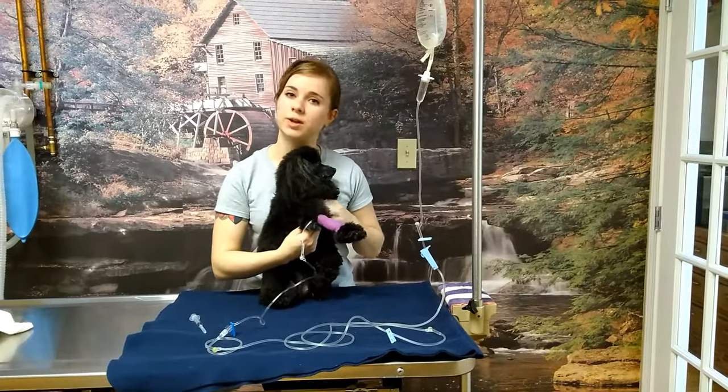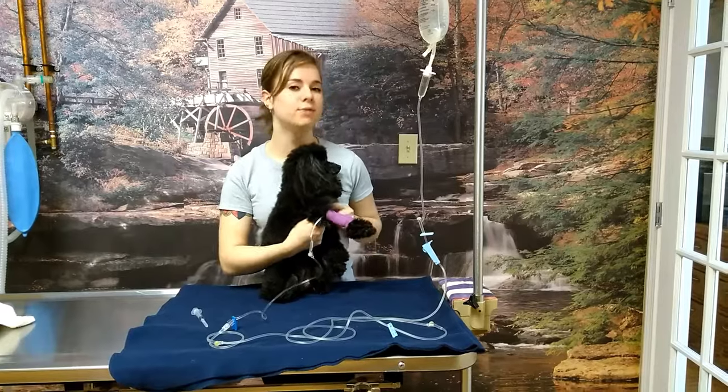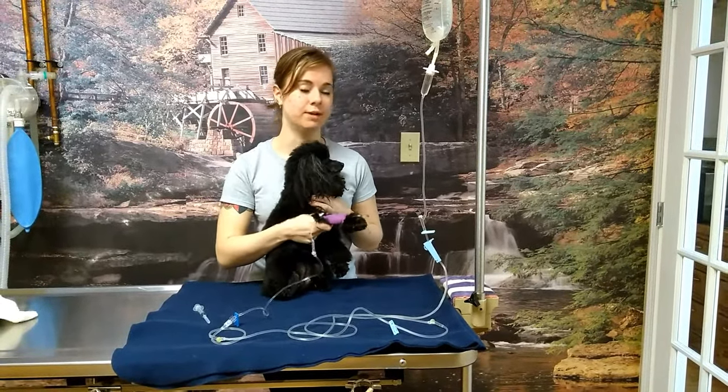You also want to feel at the top of the arm here to see if there's a little pocket of fluid possibly accumulating, in case the catheter had slipped out of the vein. But if this all feels good and we still don't have a drip rate, we move on.